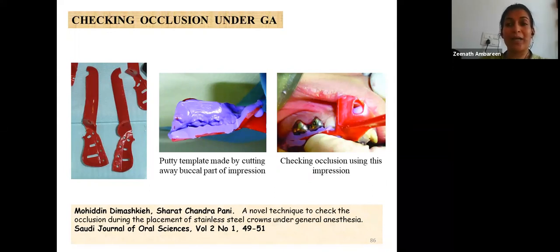Alternatively, occlusion can be checked by comparing the stainless steel crown with the marginal ridge of the adjacent tooth.